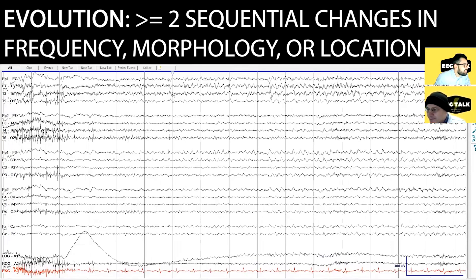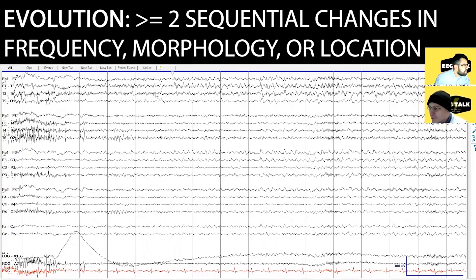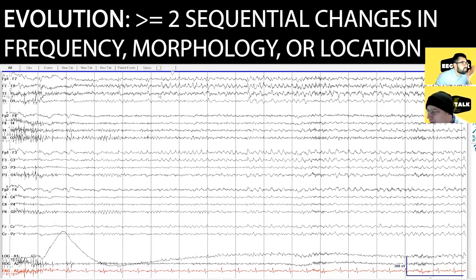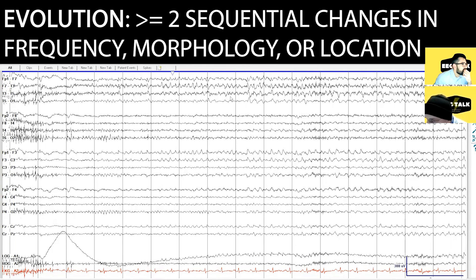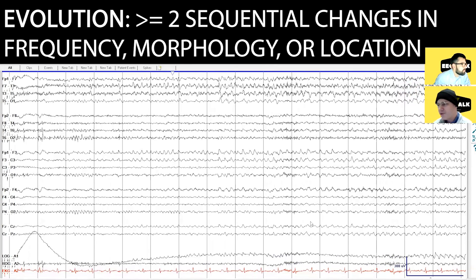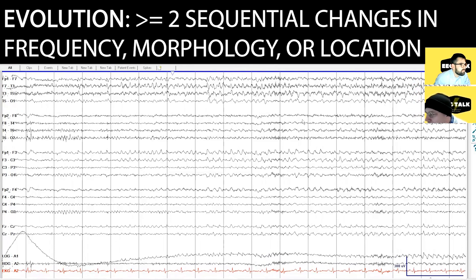There are many attributes of this signal to describe — which attributes are changing systematically? For one, I think the frequency changes a little bit: one, two, three, four, five, six... one, two, three, four, five, six, seven, eight. Is it getting faster? I'm not convinced. The morphology changes, that's for sure. Early on it's not very spiky and then it seems to get spiky. The amplitude is probably going up — it pretty quickly changes in just this one page of EEG, a dramatic change.